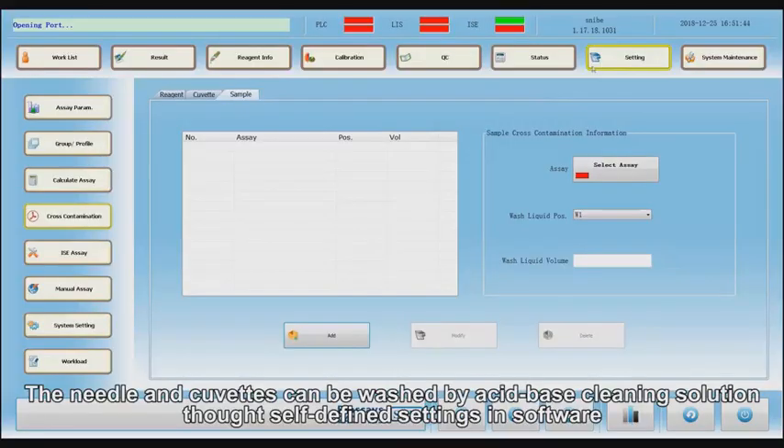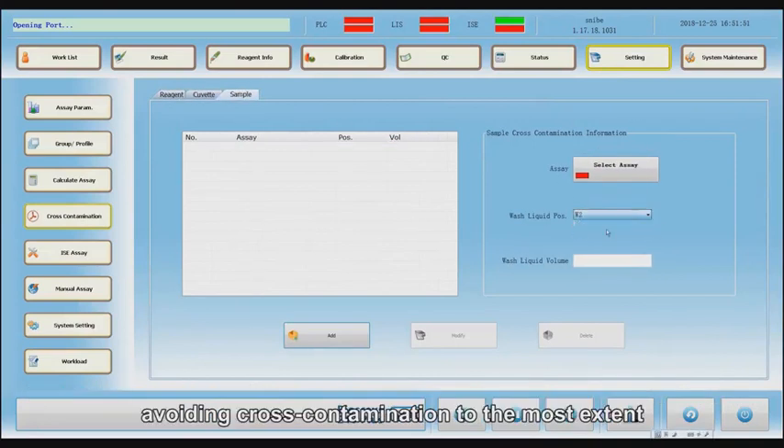The needle and cuvettes can be washed by acid-base cleaning solution through self-defining settings in the software, avoiding cross-contamination to the greatest extent.